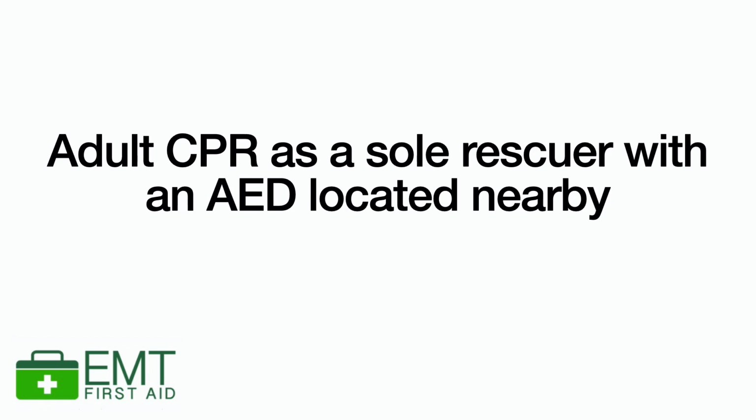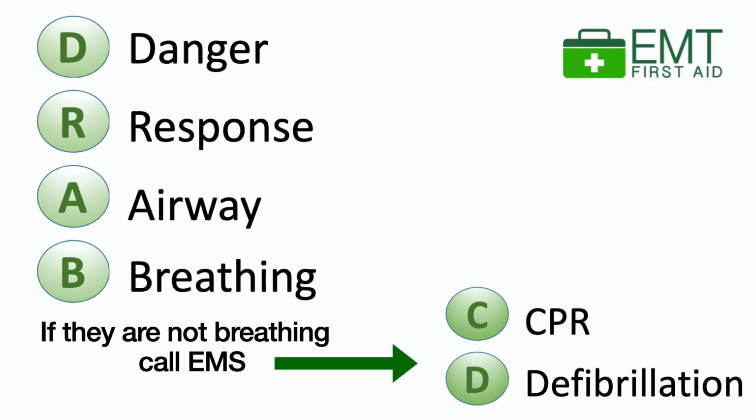Let's talk about how to use an AED, because hundreds of people are alive today entirely due to the prompt and appropriate use of a defibrillator. For every minute's delay in deploying a defibrillator, the odds of survival reduce by about 10%. So in this video, we're going to look at adult CPR as a sole rescuer, meaning you're the only one there, but you've got an AED located nearby.